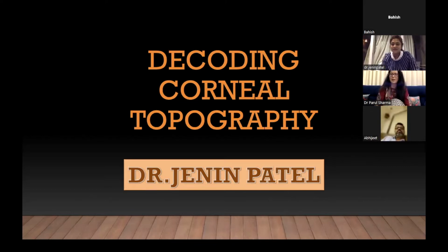It's been long pending. There were quite a few people asking how to read corneal topography better. You see these colorful scans and then you get confused. Yes, no, refractive, cataract. So how best can we utilize these machines? So we made an attempt, and we'll be doing a series of these instruction courses of an hour or so on various topics which people want to know.